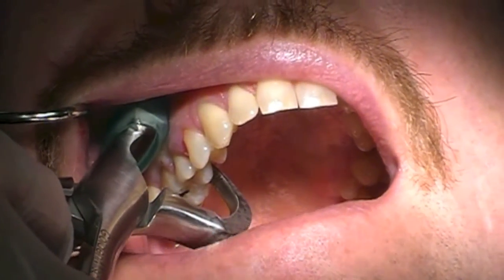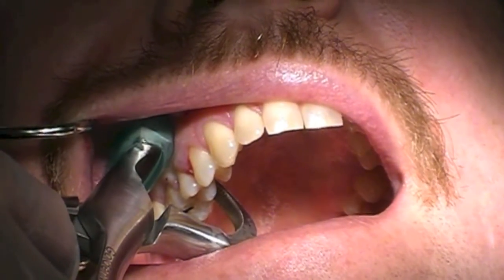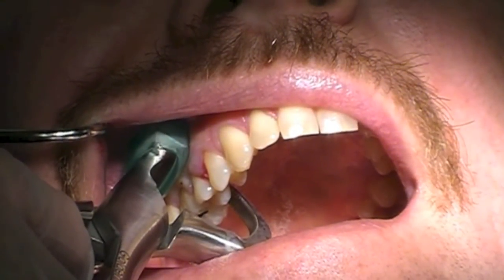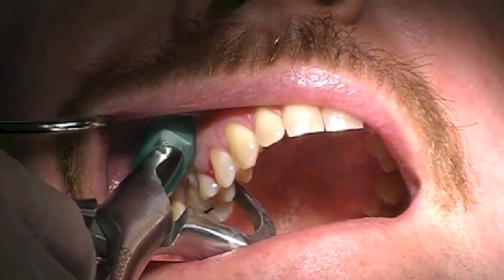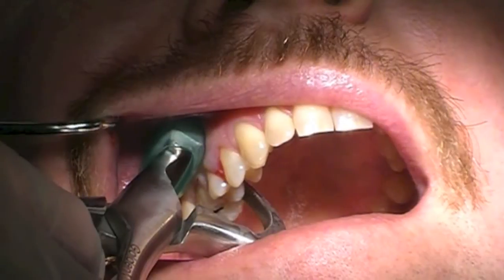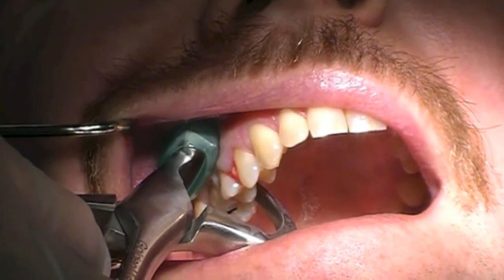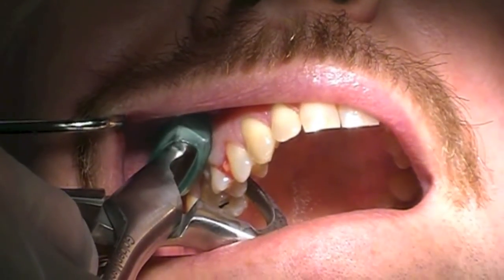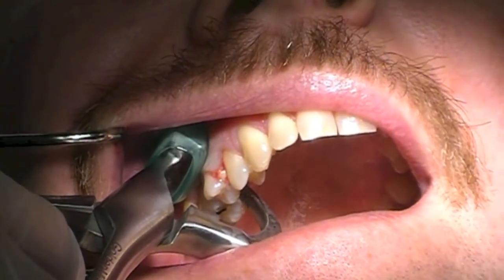Now what I'm doing is holding the forceps rather lightly and rotating my wrist. There's no arm pressure. It's a simple rotation of the wrist. Slowly, and you saw that little pop.